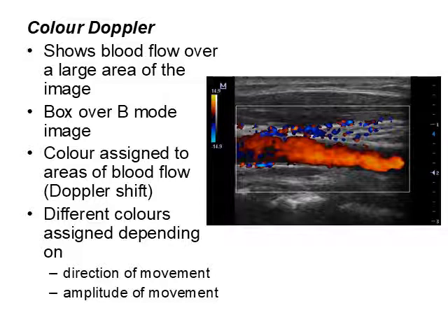Now that in ultrasound can get a little bit tricky, and sometimes it's the reason people don't use red and blue. They might use, say, yellow to green or something like that, because what this is actually showing is flow towards the transducer and flow away from the transducer. Any flow towards the transducer is going to be red, and the faster the flow, the more yellow it becomes. Any flow away from the transducer is going to be blue, and the faster it's moving away, it's going to come into a slight sort of teally greeny colour.